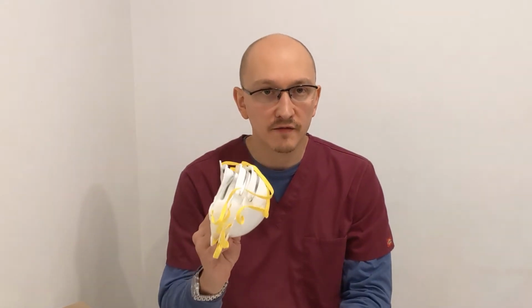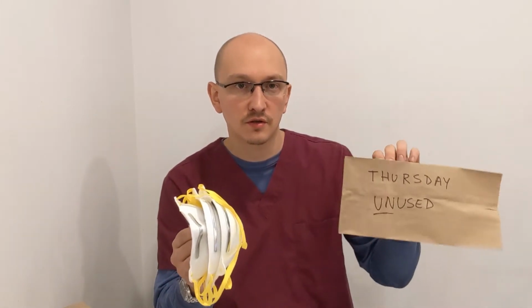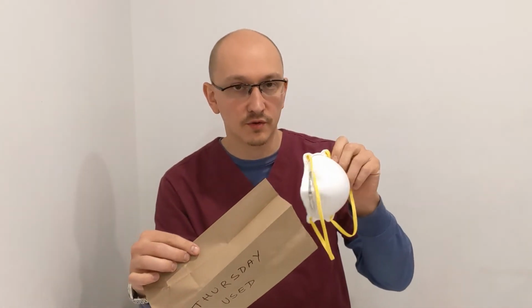Think about how many patients you have for that day, and that's how many N95 masks you're going to need. Say today is Thursday and you're seeing 3 patients. This is your Thursday bag and three N95 masks. Start your day with all of them in the unused bag. Get to a patient's home. Put on your first mask. See the patient. When you leave the home, obviously perform hand hygiene, and then place the mask carefully into the used bag. Get to the next patient and repeat the process.